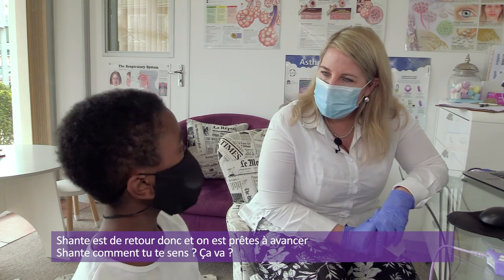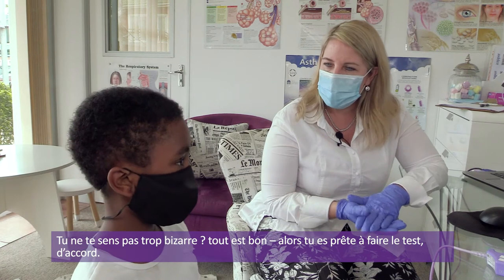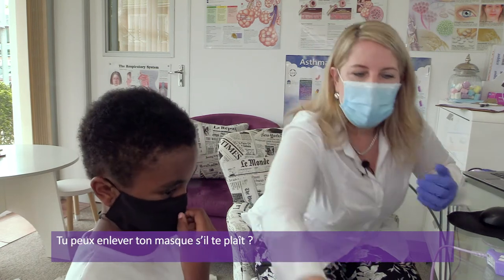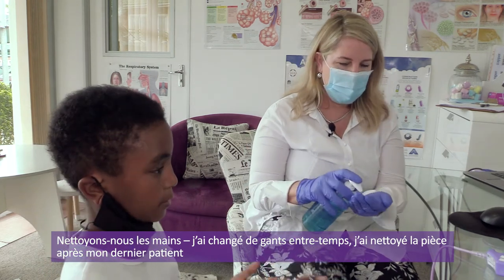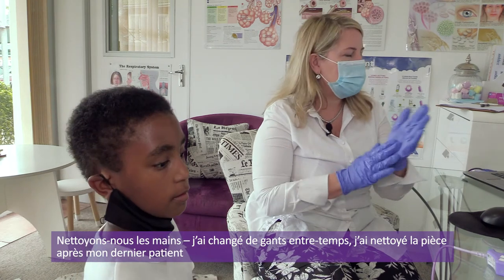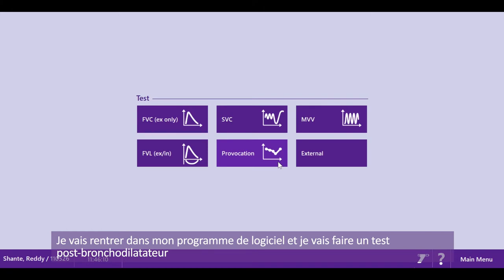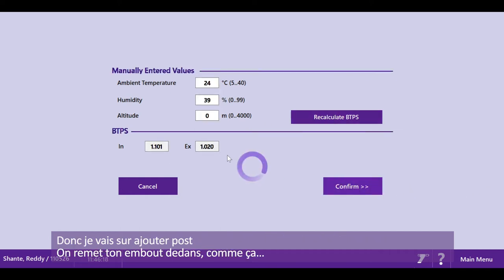Shanti, how are you feeling? Good. You okay? You don't feel too shaky? No. Everything's good. So you're ready to do the test. Okay. Can you take your mask off, please? Okay, so I've changed my gloves in between. I've cleaned my room after my last patient, and we are ready to go. So what I'm going to do is go back into the software of the machine, and I'm going to do a post bronchodilator test now. So I go to add post.